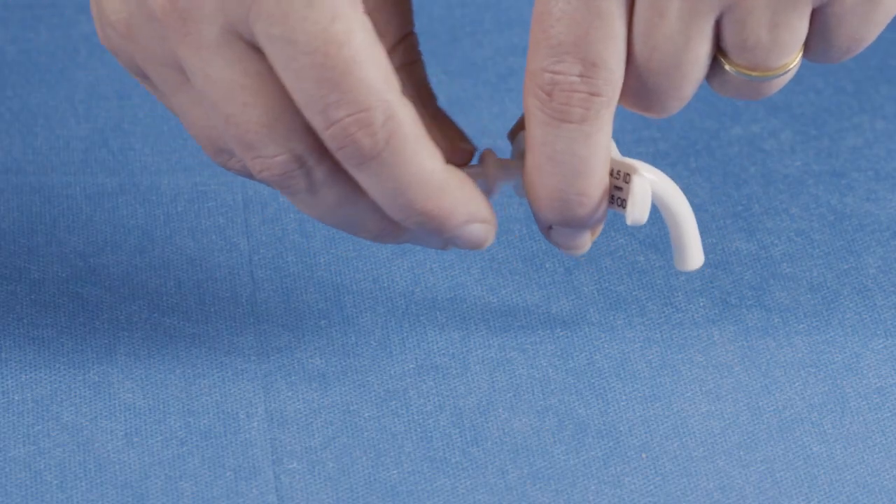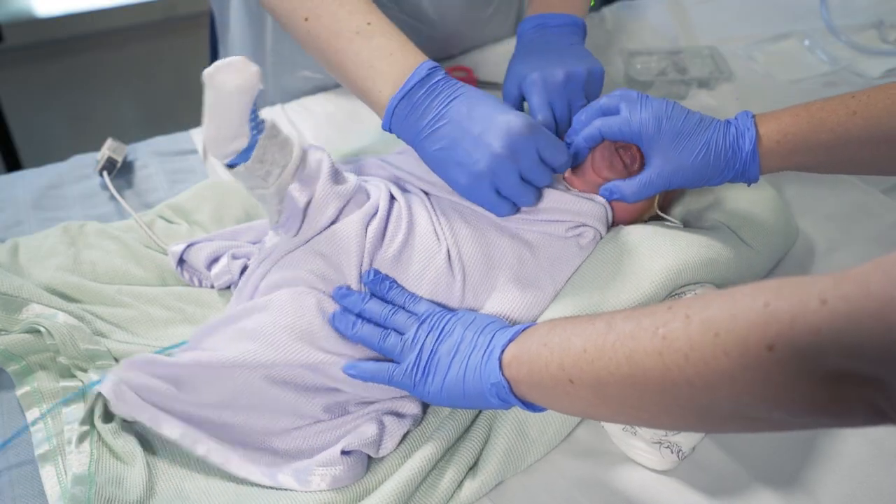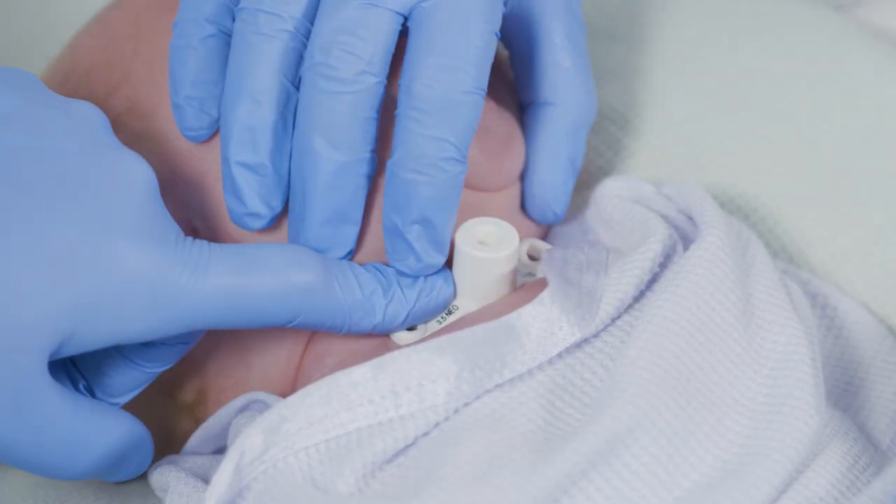All the tracheostomy tubes that we use for children have an introducer. That's basically there to support the tube while you're inserting it — it's just to give it some shape. Then as soon as the tube's in place, you have to remove the introducer to allow the child to breathe.